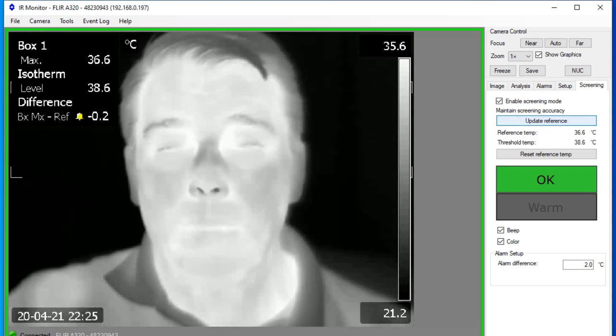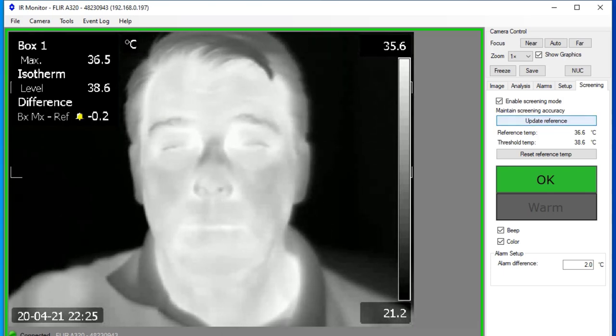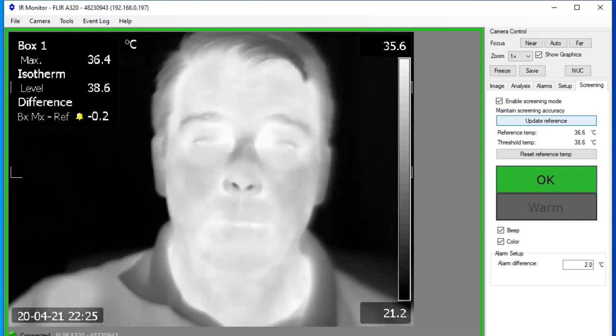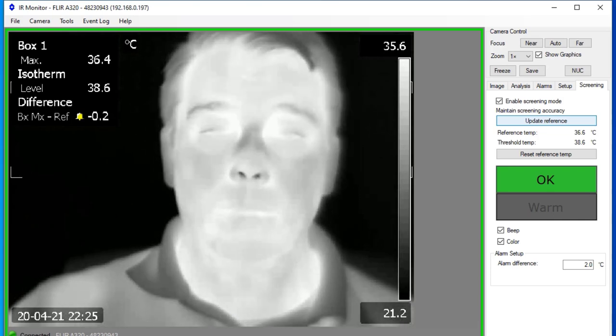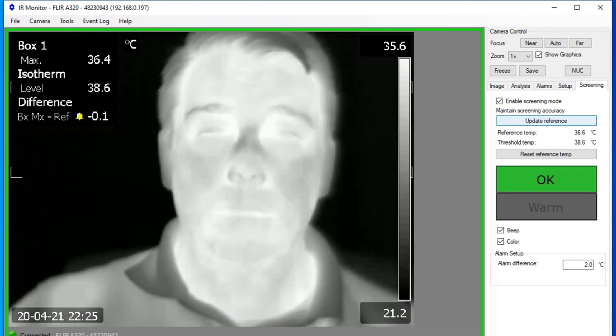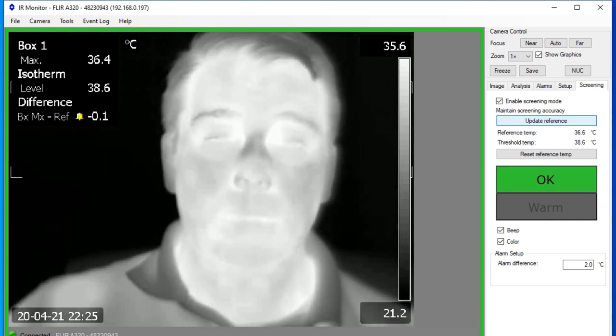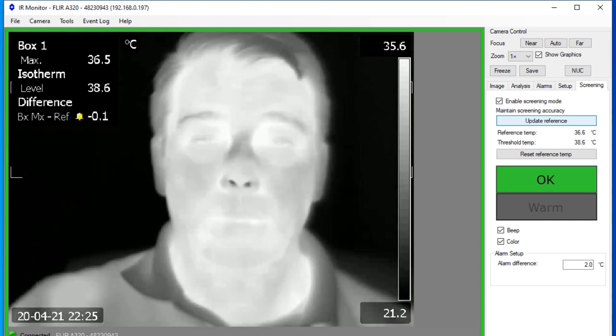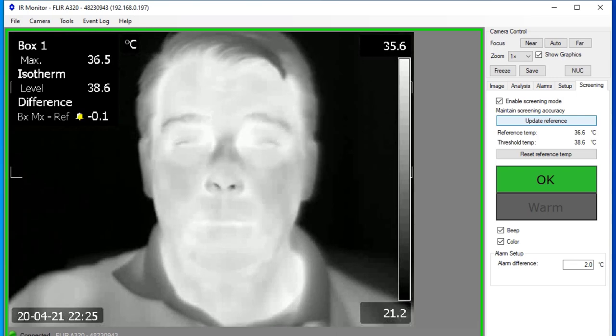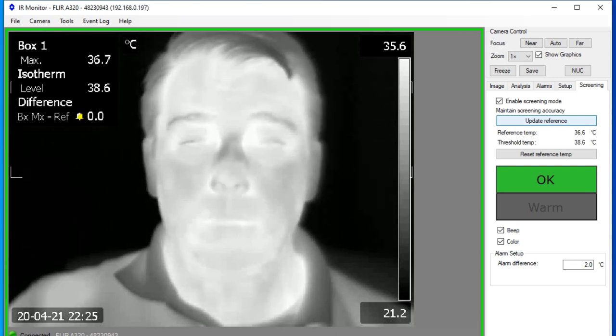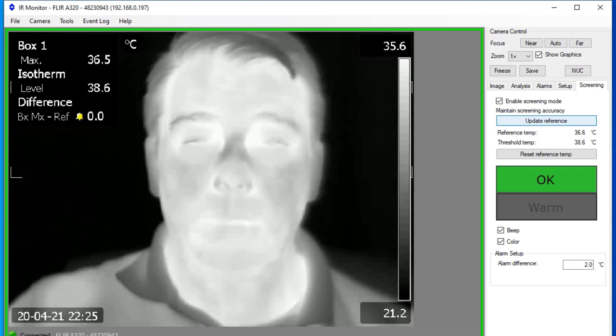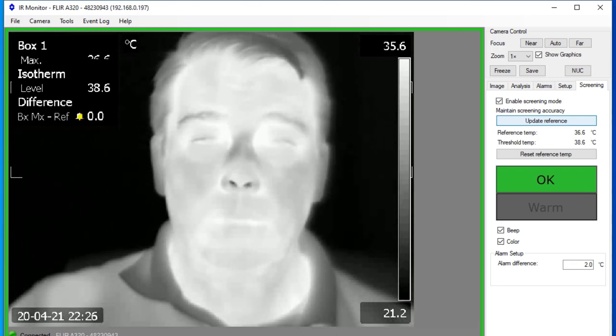For that, you take 10 individuals with a known good body temperature, present the individuals to the camera, snap their images, and build a population baseline by pressing the Update Reference button. And then you're ready to screen.